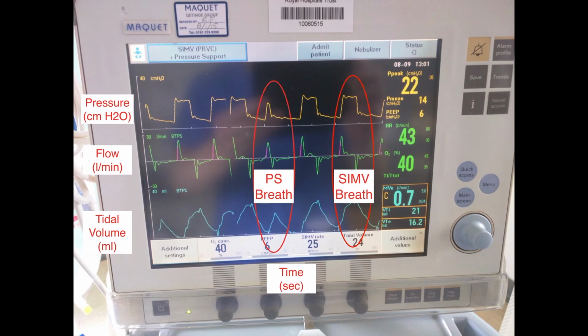So this next graph provides a nice summary of what the ventilator does and what the graphs display. So I see the top graph, pressure against time, the middle graph, flow against time, and the bottom graph, tidal volume against time. And you can get a nice picture of the difference between the two breaths here. So this is a patient, the respiratory rate set at 25, but you can see from the graph there, they're currently breathing at 43 breaths per minute. So 25 of the breaths are going to be the big SIMV PRVC breaths, and the other 18 breaths are going to be pressure support breaths.